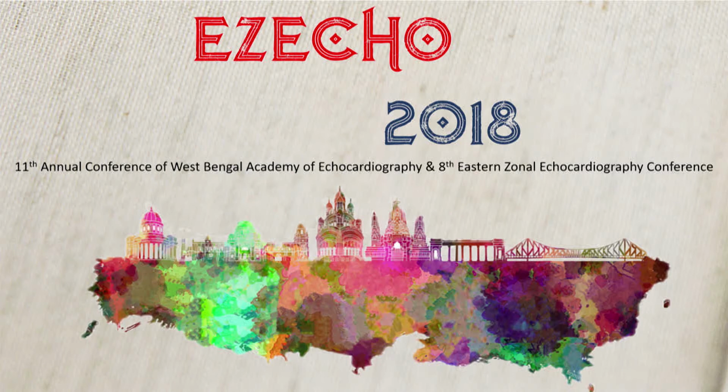He showed nicely the sinus venosus ASD, but for the students, I want to mention one point. Sinus venosus ASD actually is not an ASD, that is, not an interatrial communication. It is a communication, a gap of the sinus venosus septum between the right upper pulmonary vein and the SVC. So when you are getting a sinus venosus ASD, you should look at the right upper pulmonary vein. That is very important, because inevitably sinus venosus ASD means it is a right upper pulmonary vein communicating with the SVC. So that point should be addressed.